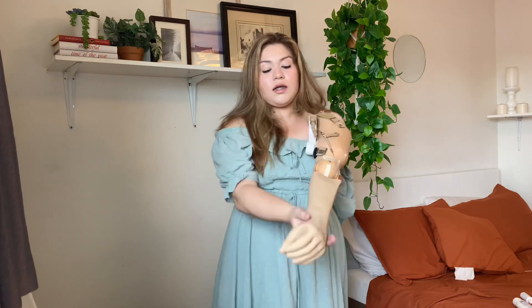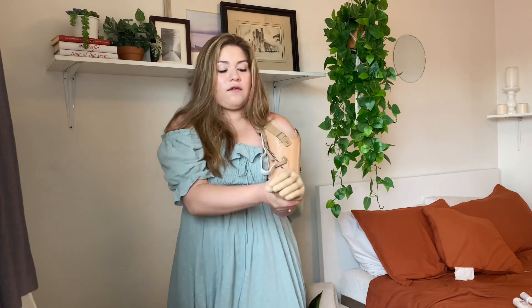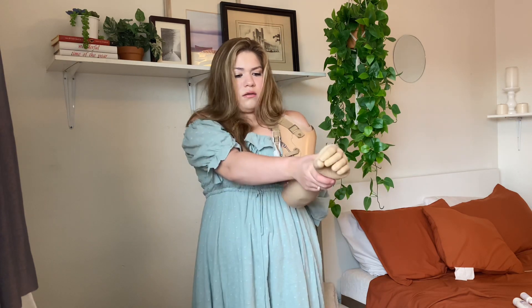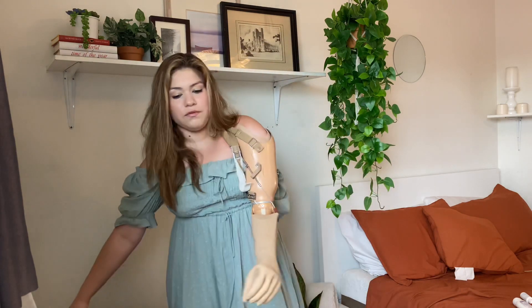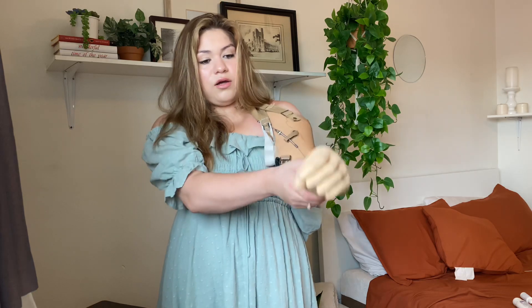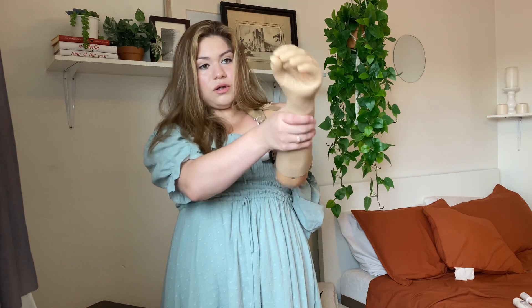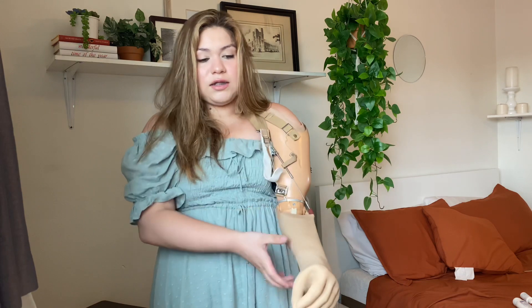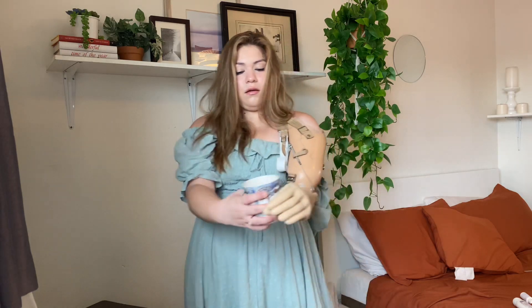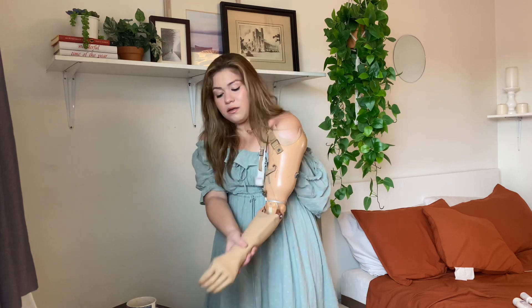People also ask me if my fingers can open, and I'm going to show you exactly — they can open just a little bit. If I want to open them, watch. Let me move this table. If I want to move my fingers I can — I move them in and then out, open and close, open and close. So let's say I want to get something — like if I want to get this cup.